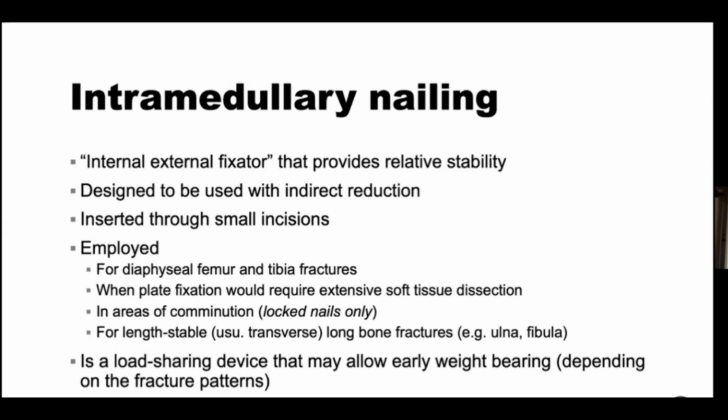One of the major benefits of intramedullary nails is that locked nails, which are nails that have bolts at the proximal and distal ends, so on either side of the fracture site, are load-sharing devices that may, in many circumstances, allow early weight bearing. Some of it does depend on the fracture pattern, but there's more and more evidence that we can allow early weight bearing on locked intramedullary nails because you've created a rotationally stable and length stable construct. That creates a load sharing device. So again, it allows patients to mobilize early, which is one of the principles of internal fixation that we talked about.